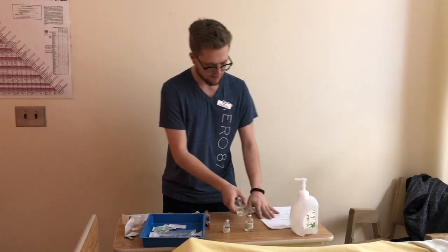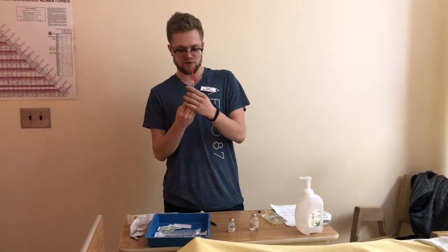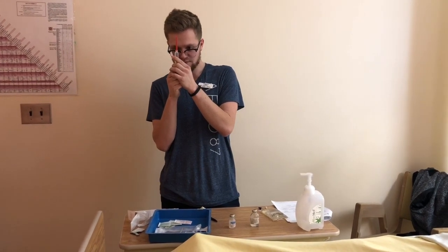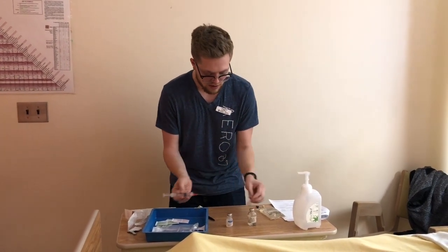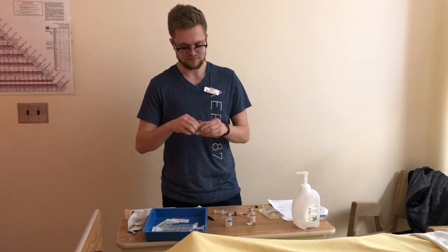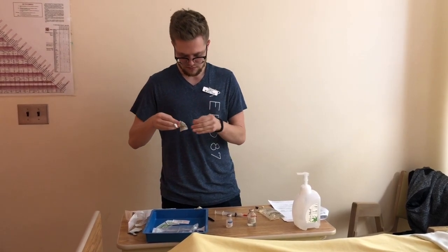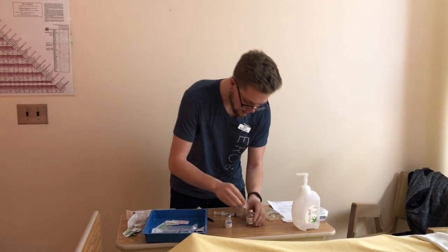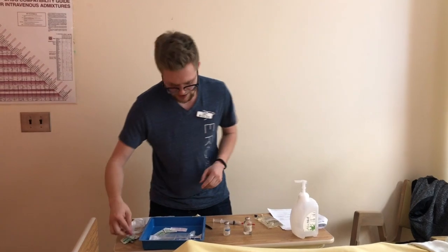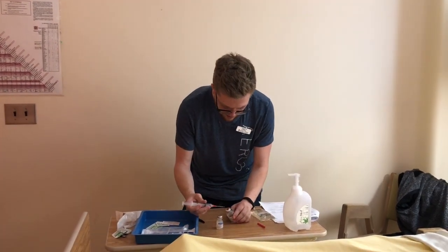So before we do that, though, we're going to want to take it out and then also do our second med check as well. So now that I have this, we're going to want to make sure that I get my 4 mLs of air, because we're taking out 4 mLs from the final volume of 8 in there. So, before I do that, let's do one more swab. So again, 30, and then we'll let it dry for 30 as well. So like that. So now I'll be using, make sure I have the 4 mLs of air in there.